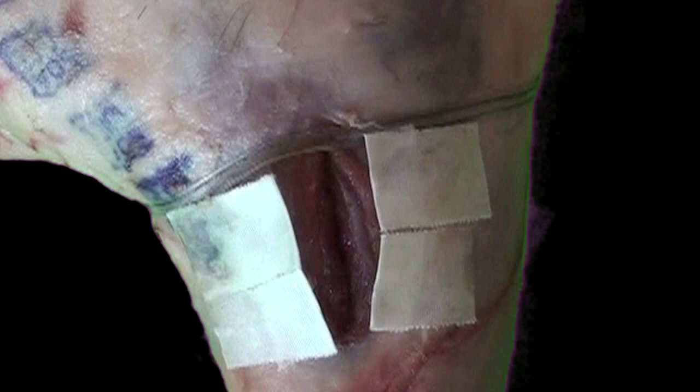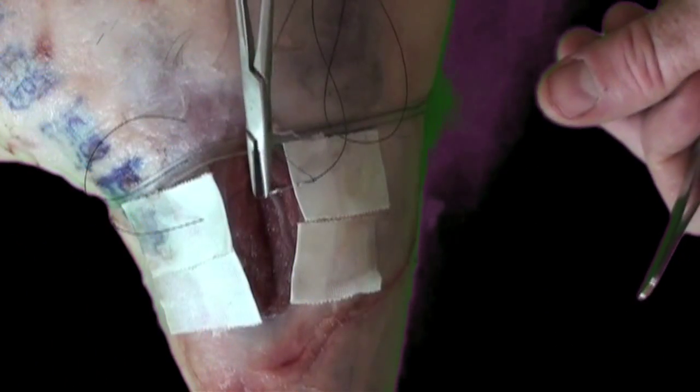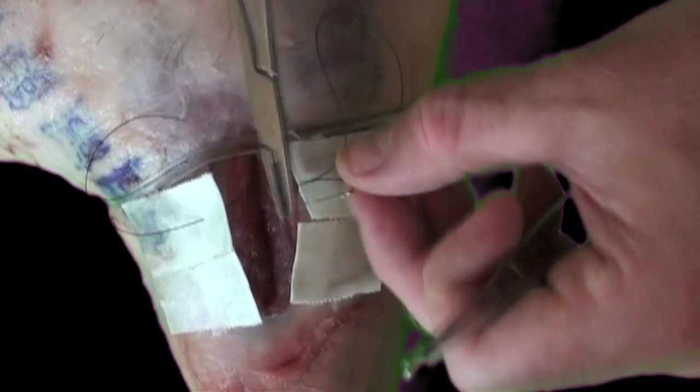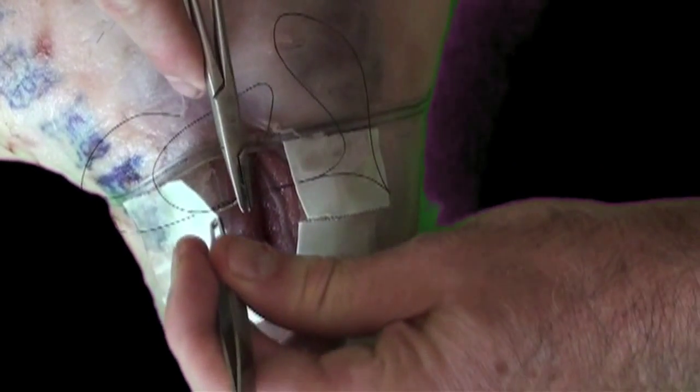Keep them in place until they're really firmly bound to the patient, and then you're gonna sew through the tabs. You have to use a mattress suture — like a vertical mattress — to keep from slipping through the tape, and I recommend using a braided suture because it has a bit more grip. Silk is always good. Then you just tie that suture down and the wound margins pull together really nicely.